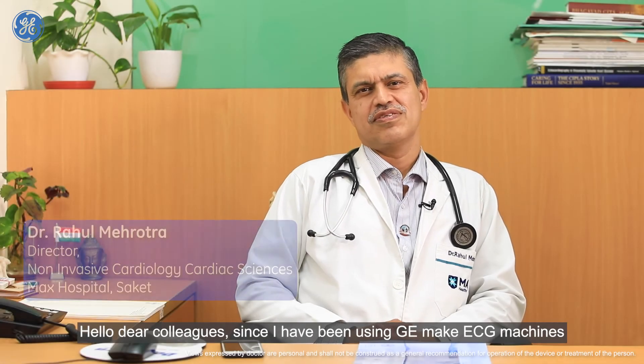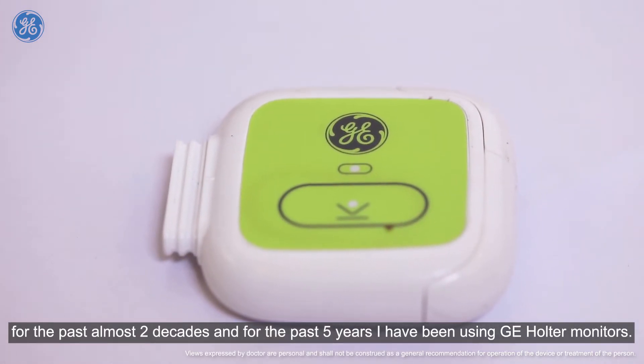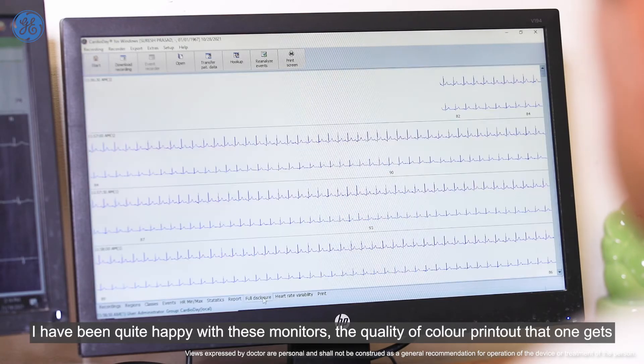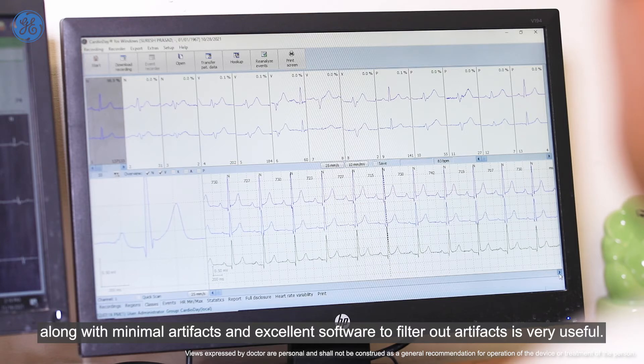Hello dear colleagues. I've been using GE ECG machines for the past almost two decades, and for the past five years I've been using GE Holter monitors. I've been quite happy with these monitors — the quality of colored printouts one gets, along with minimal artifacts and the excellent software to filter out artifacts, is very useful.